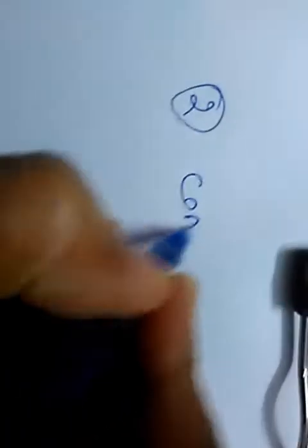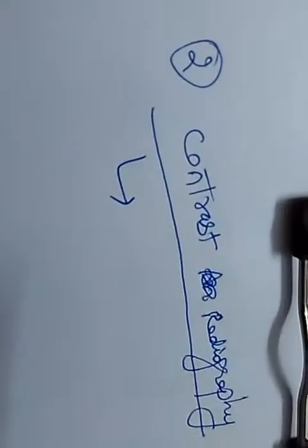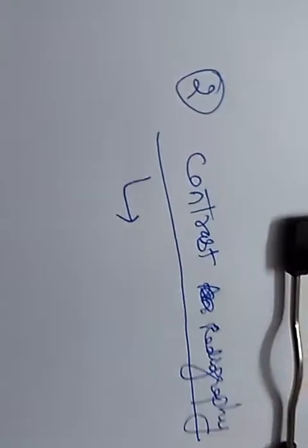Now second is contrast radiography, that is, using contrast. The contrast which is normally used should attenuate the X-rays.